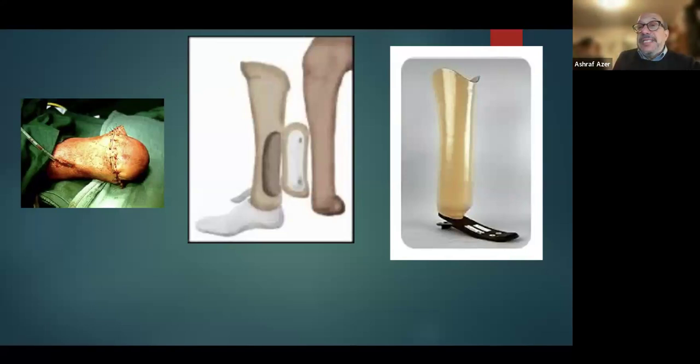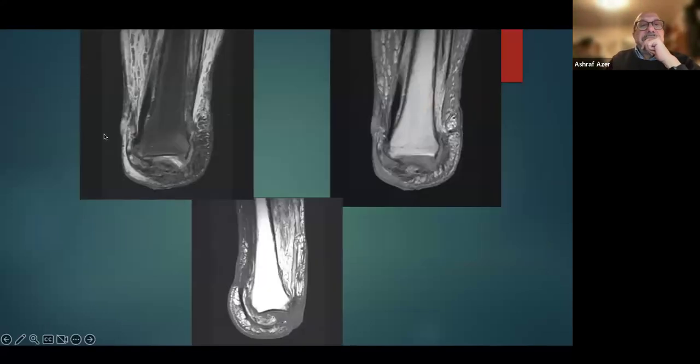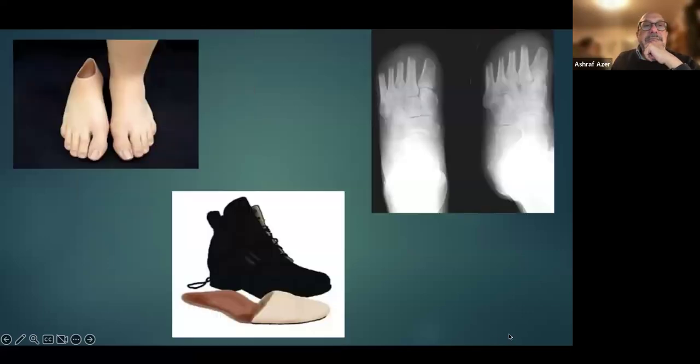Is that okay? This is our basic principle, by the way. And what is that? MRI. Look at this. What is that? It's a drift of the heel pad. Why? A surgeon didn't pay attention. He did myoplasty only, and it ended up with a posterior drift. The Achilles tendon fibrous tissue is pulling. Okay? Now, what is that?